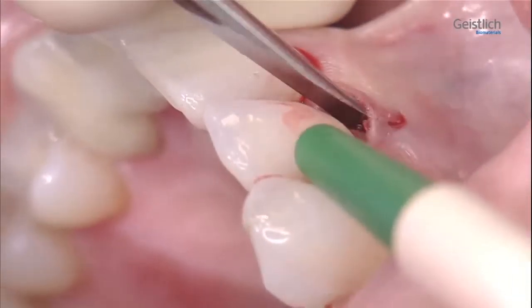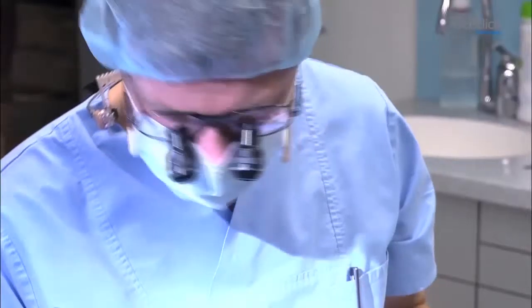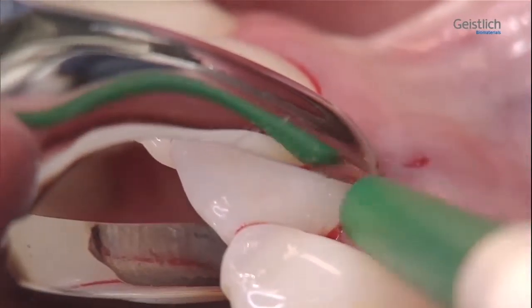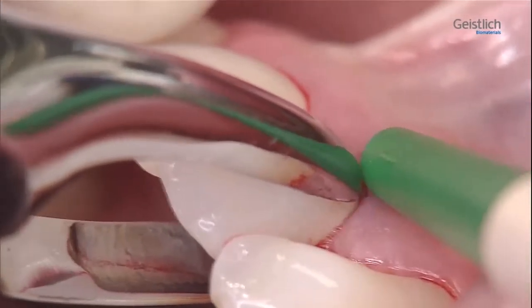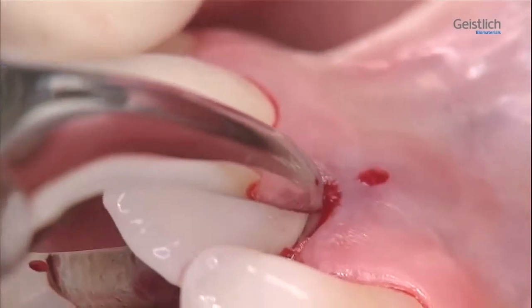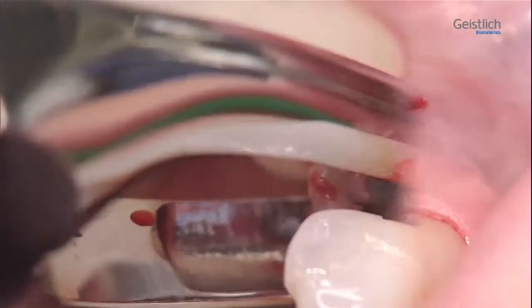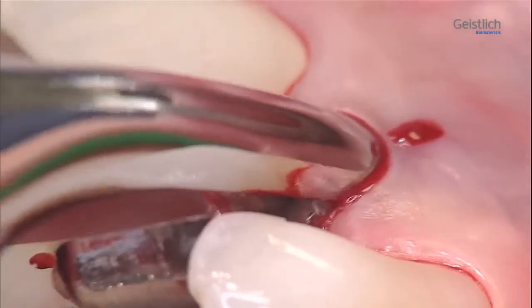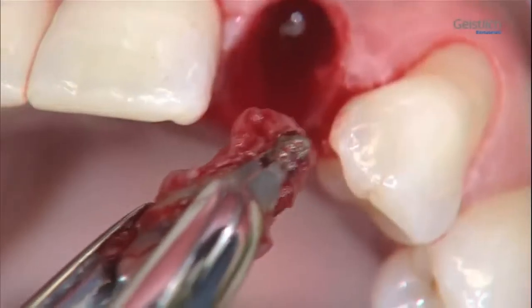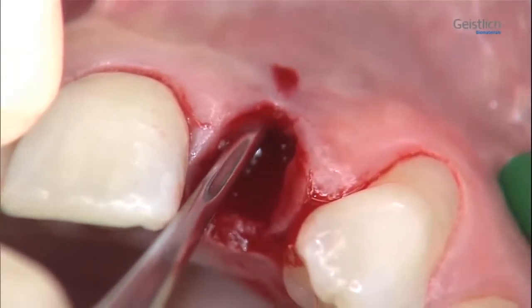We now mobilize the tooth with a small lever instrument and extraction tools according to Carl Ludwig Ackermann, and remove it with an extraction forceps using careful rotational movements. Occasionally, as in this case, the prosthetic crown can be lost during this process. But the final removal of the tooth will pose no problem. Here, we can clearly see that the buccal bone plate is missing.